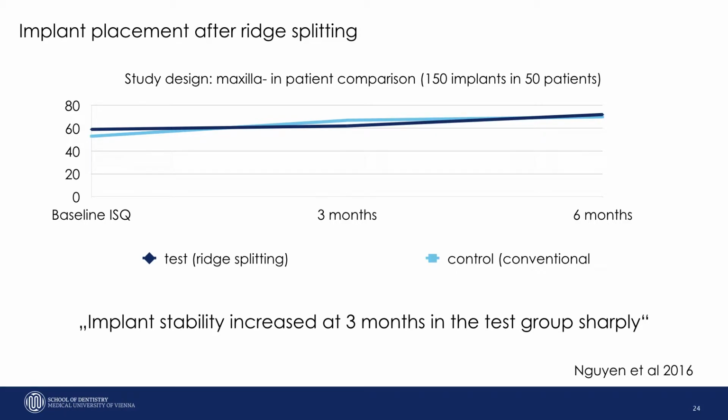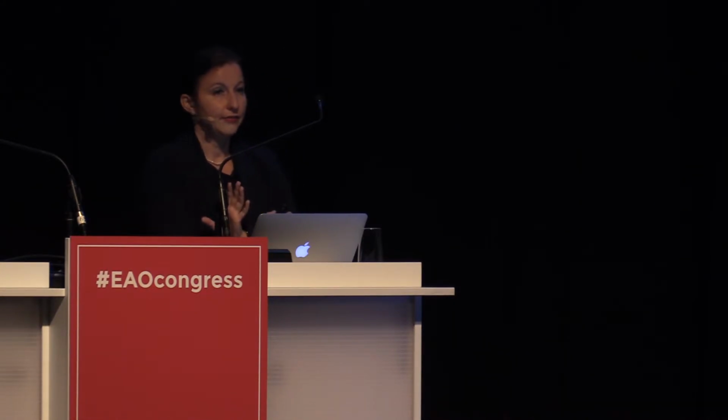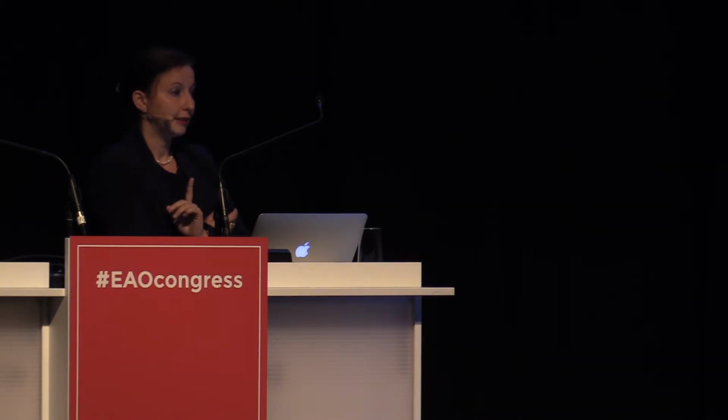And I think it's very nice to show this slide after Paul's slide with this implant case where he did the simultaneous bone augmentation, because I think that implant stability behaves a bit differently when we also do bone augmentation. And again, for me, this is a very critical situation, and that's why the implant stability measurement at this time is a very good tool.